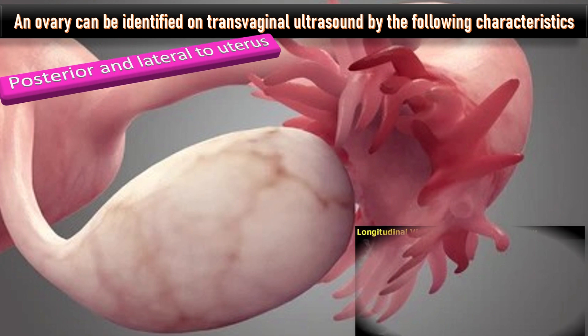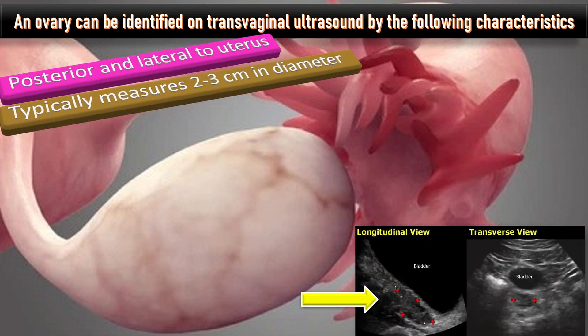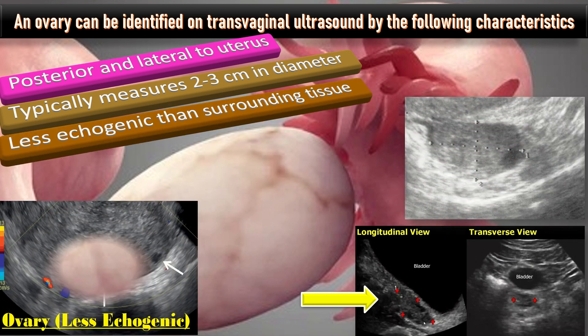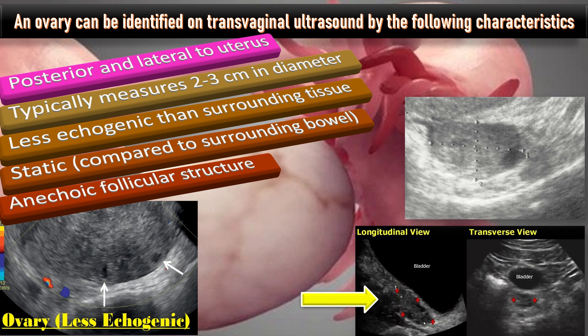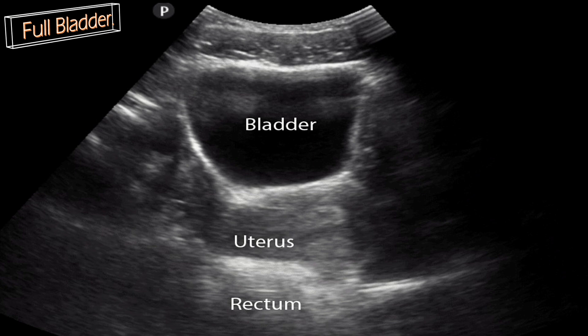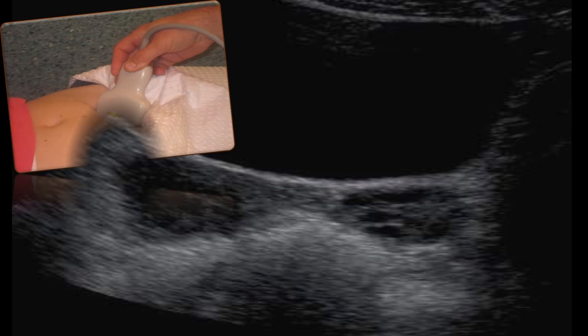The ovary is posterior and lateral to the uterus. It typically measures two to three centimeters in diameter. It is less echogenic than surrounding tissue, more static compared to the surrounding bowel, and it has an anechoic follicular structure. Use the full urinary bladder as an acoustic window to angle across the ovary.